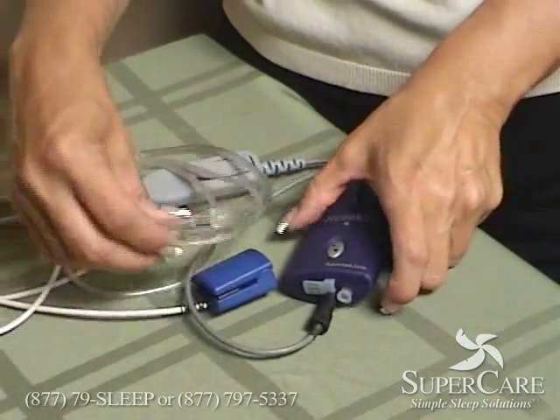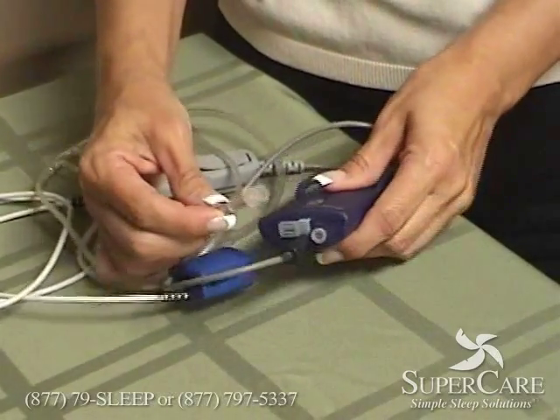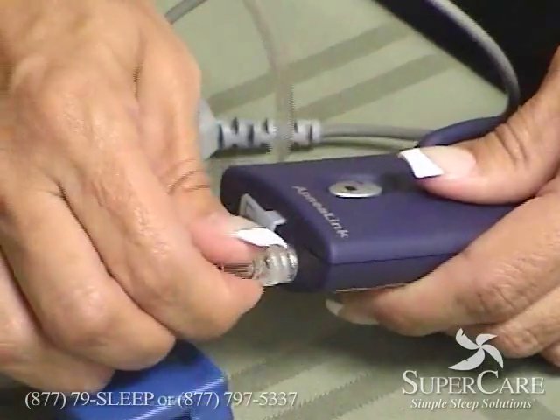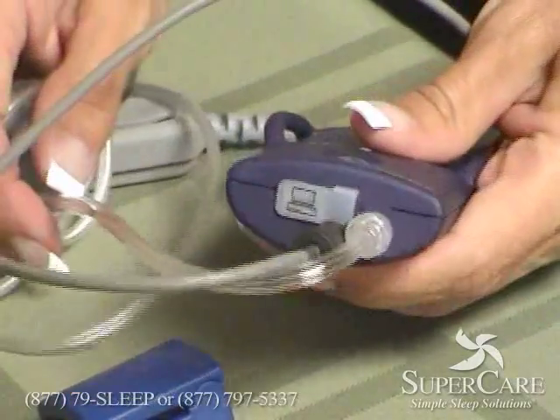Next take your cannula out of the bag and the end of the cannula will screw in to the clear piece next to where you connected the connector.